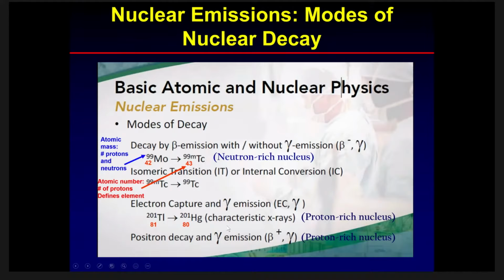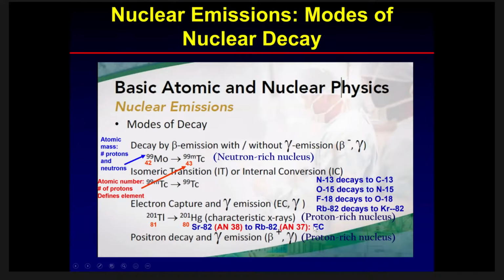And then we have many different positron emitters, such as strontium, which decays into rubidium, which is our positron emitter, through electron capture, where the nucleus captures an electron, changes a proton to a neutron, and you change the element from strontium to rubidium.